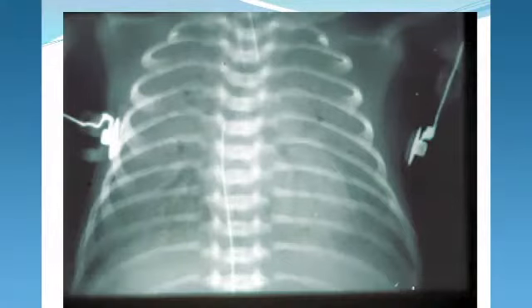On the other hand, you have this baby whose lung is white, has air bronchograms, who clearly is inadequately inflated. But if you count ribs, ribs are right about 9 ribs. And so some people say, well, he's 9 ribs, that's okay. Well, the answer is it's not okay, because this patient is inadequately inflated and needs a higher mean to get the lung inflated. Once inflated, you should be able to back off on the mean airway pressure.